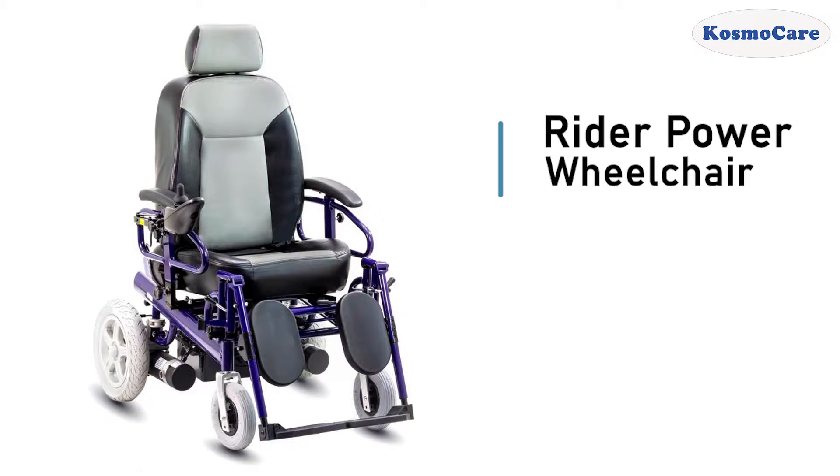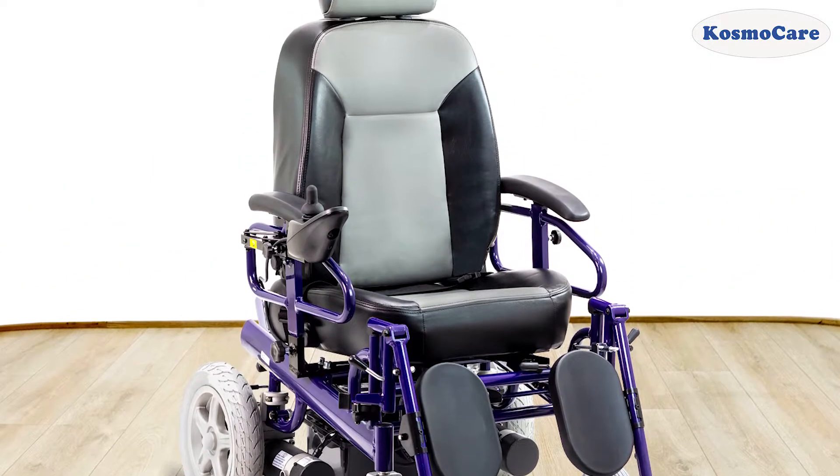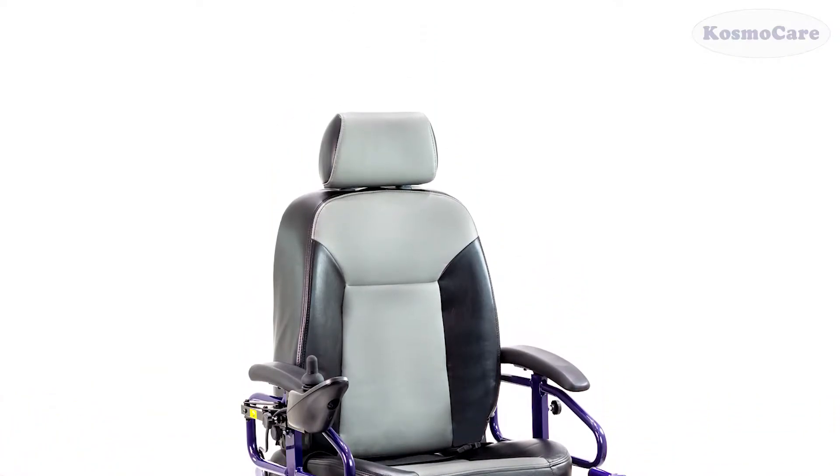The CosmoCare Rider Power Wheelchair gives people with limited mobility an extremely comfortable and convenient solution to go places.